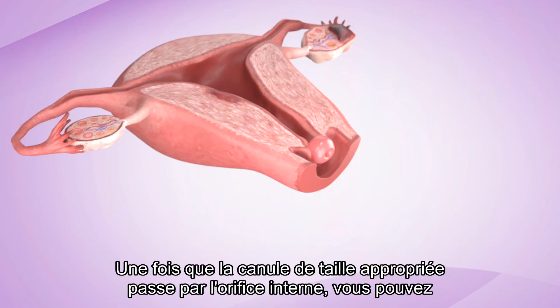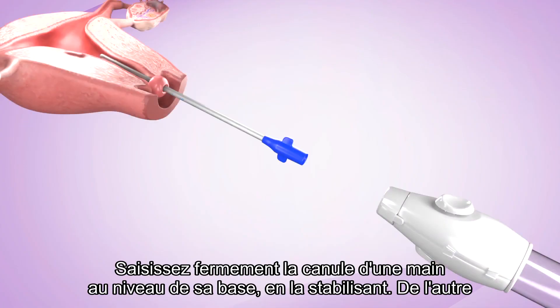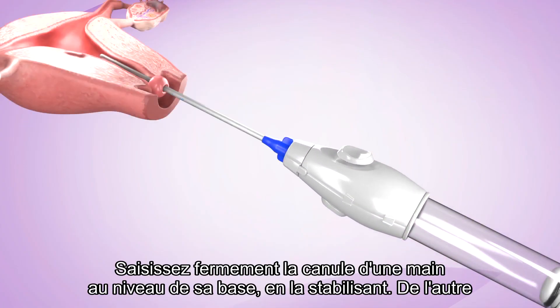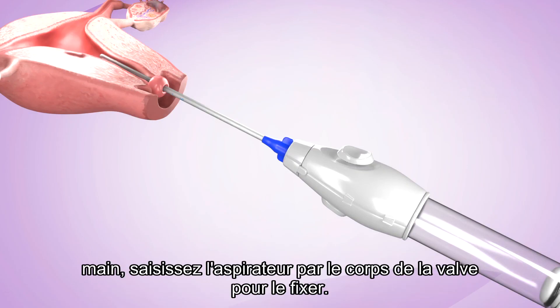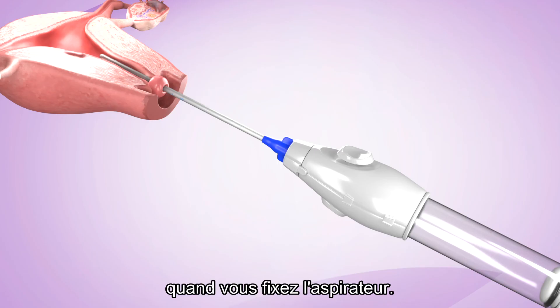Once the cannula of the appropriate size passes through the internal os, you can attach the prepared manual vacuum aspirator. Firmly grasp the cannula at the base with one hand, holding it steady. With the other hand, hold the aspirator by the valve body to attach it. Make sure that the cannula does not move forward into the uterus as you attach the aspirator.